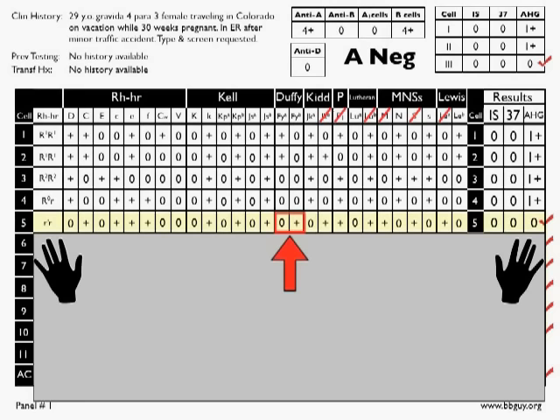Then in the KEL system, we've got multiple different pairs here. We've got JSA and JSB, again, double dose expression JSB, single slash. Next, KPA and KPB pair, same thing with KPB, double dose expression, single slash. Big K and little k, double dose expression of little k, single slash.